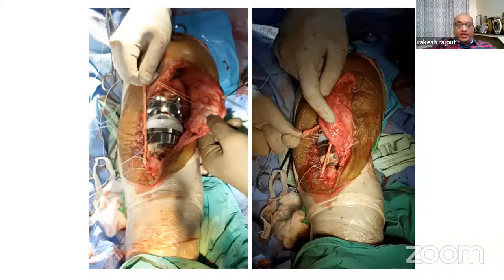So here we've taken a semitendinosus. We have taken the gracilis also. Also a small sliver of quadriceps and used fiber tape. All those four things were used because it is not easy to replace the patellar tendon just with hamstring. So you need to actually supplement a lot more. Ideally, in an ideal world, if you know beforehand, I think you can get hold of cadaveric grafts, the patella grafts, or even Achilles tendon, which you can actually reverse and put here. But if you're on the table, you're stuck like this, or you have partial ruptures, this is a bailout technique for you.